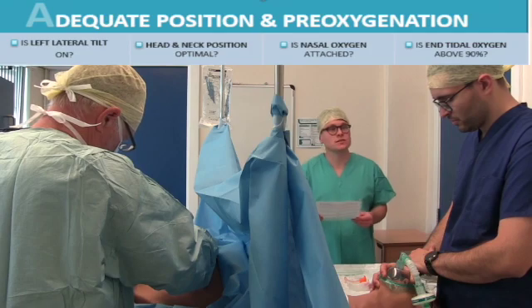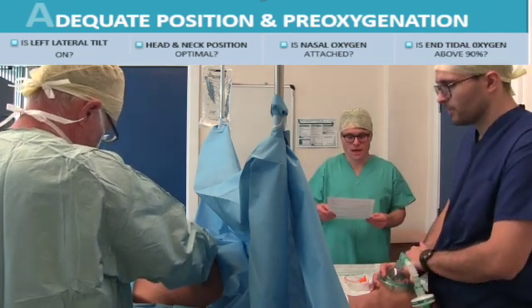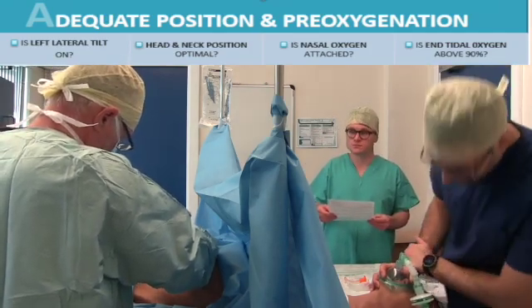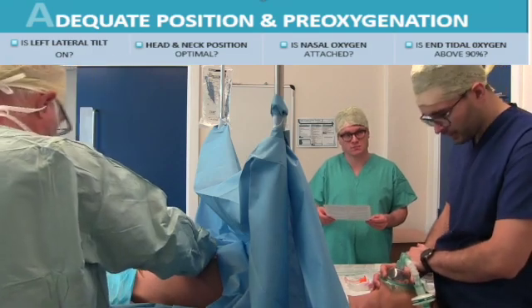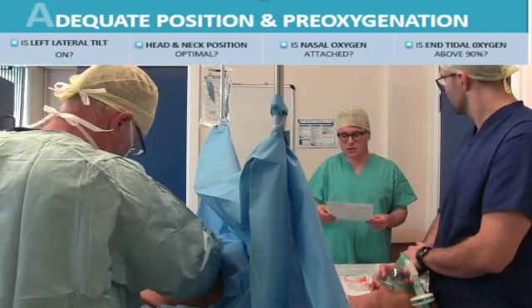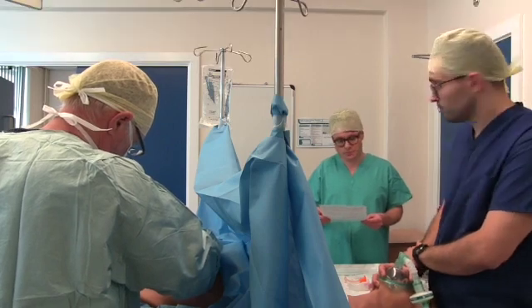Moving on to the next part. Is left lateral tilt on? Yeah, that's on. Head and neck position optimal? Yeah, I'm happy with those. Is nasal oxygen attached? Yes, it is, it's running. Is end-tidal oxygen above 90%? It will be.